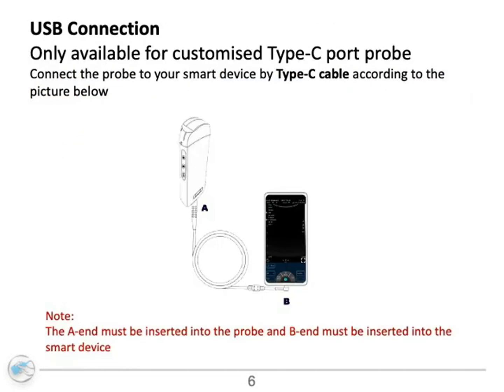Note, the password is the serial number of the probe, all in small letters. USB connection. The USB connection is only available for customized Type-C port probes. Connect the probe to your smart device by Type-C cable according to the picture below.